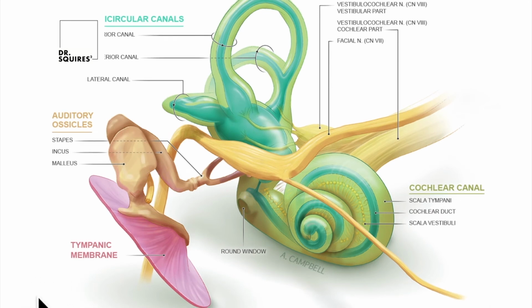We put sounds into the ear, which vibrate the system. They vibrate the basilar membrane, which corresponds to a certain grouping of cells at some point along the cochlea. Those outer hair cells will give us a response back, which then travels back out of the cochlea, across the ossicles or the ossicular chain, and back out into the ear canal where we measure it.